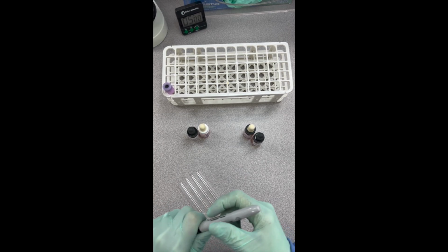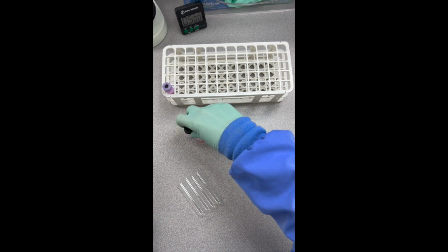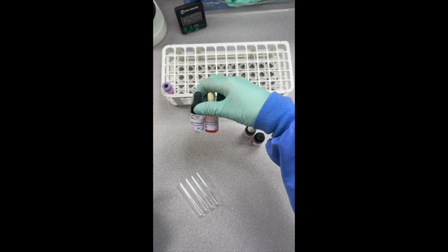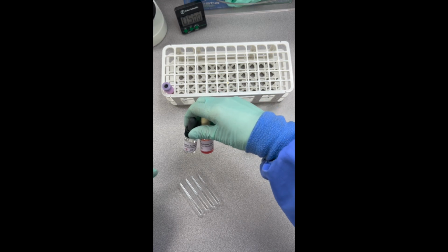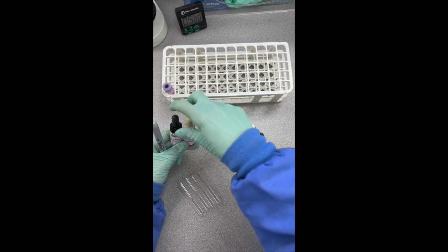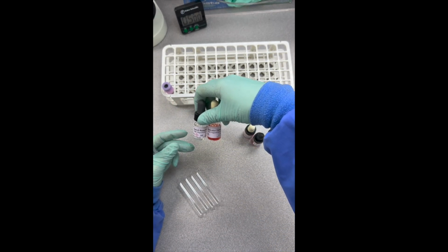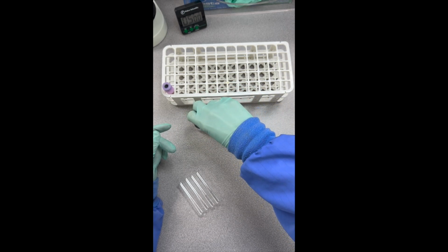Hi everyone, we're going to work on a fetal screen today. What it is utilized for is to detect Rh positive cells in a mother's bloodstream after she delivers a baby. We want to see if any of those baby's blood cells have mixed with mom's blood in her circulation. And so we're going to set this up, and then I'll explain a little bit of how the test works.